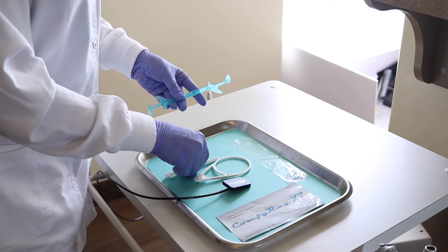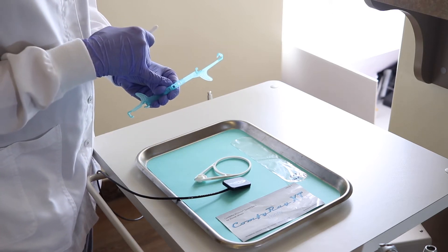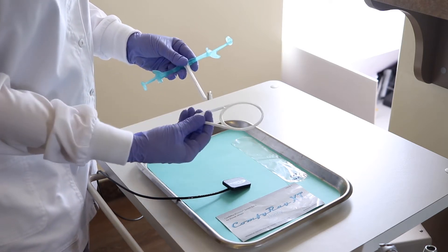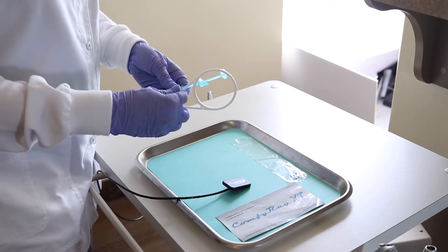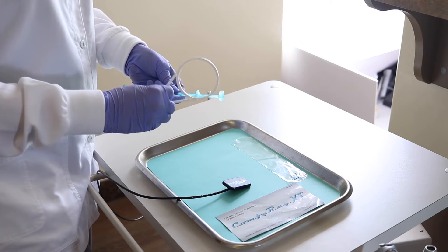Here's your holder, here's your rod, there's a small pin in the middle that will go into this small hole in the middle, and then you're going to place your ring. This positioner clicks into three positions: low, medium, and high.